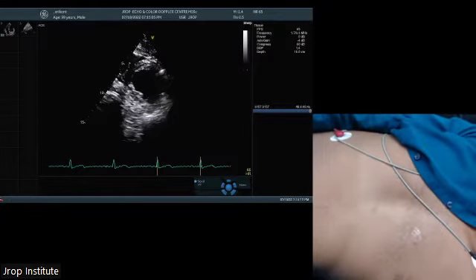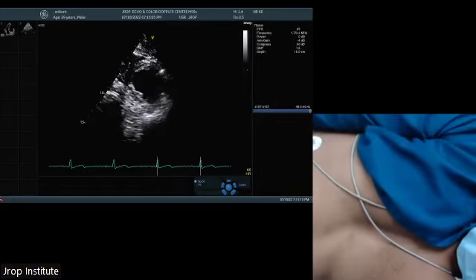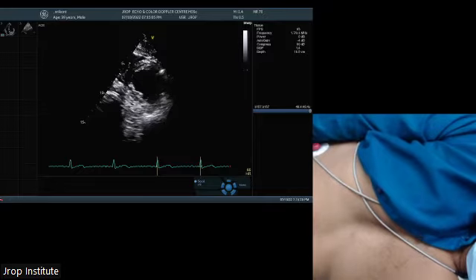Dr. Mahmood Iqbal: Sir, what is the direction of the marker in supraesternal views? 1 o'clock. 1 o'clock. Okay, sir. Thank you, sir.